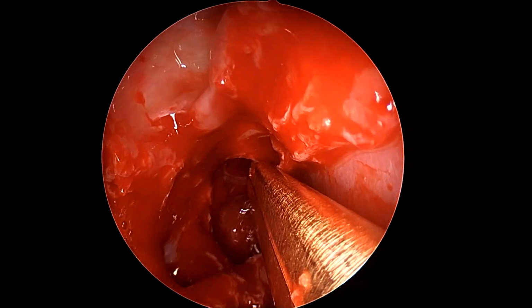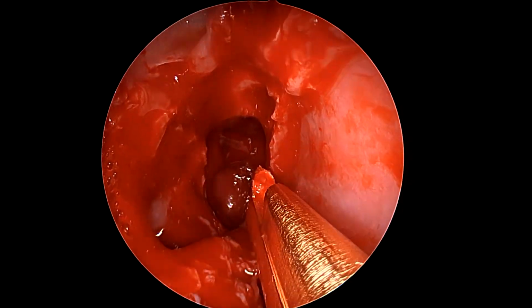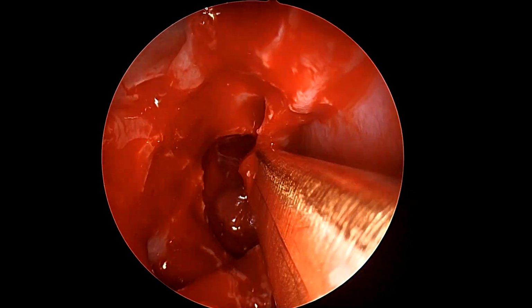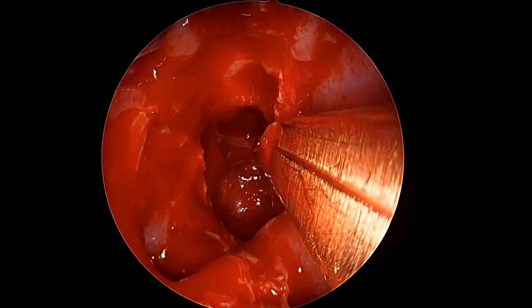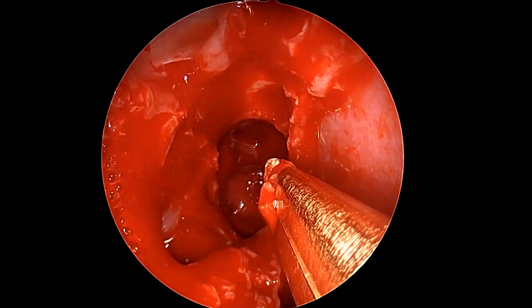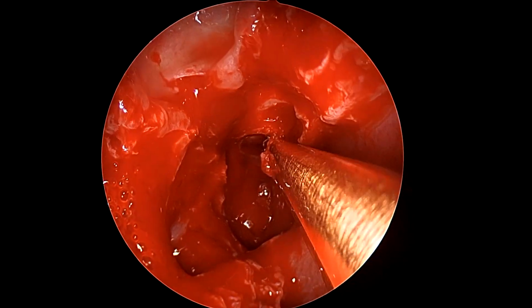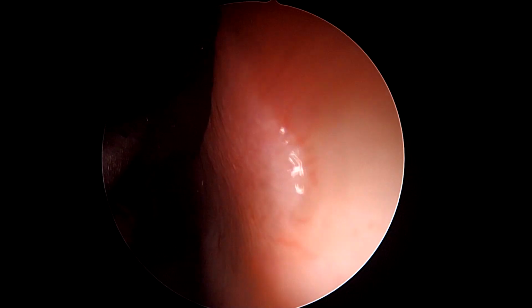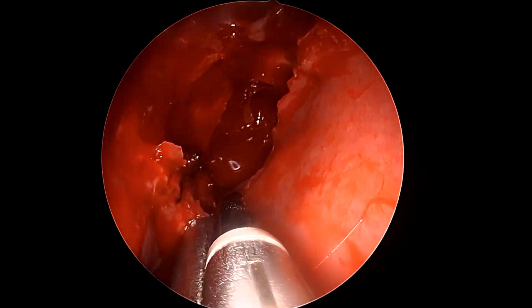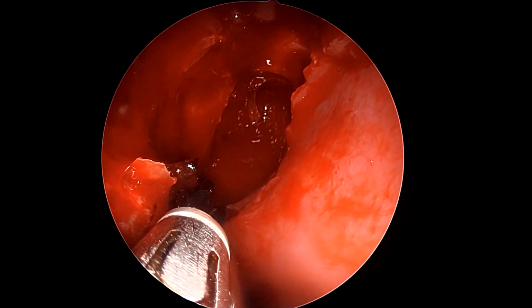On the right side, we have very little to lose since the optic nerve is already gone for the past 20 years, but the internal carotid is still intact. More important to understand in these patients is that this has been once operated as well as post-radiation. So in post-radiation tumors, we generally avoid being too surgically aggressive. These tumors can be variably fibrosed, can be adherent to the internal carotid, and any unnecessary avulsion or pull on these tumors can lead to significant injury or internal carotid ruptures.